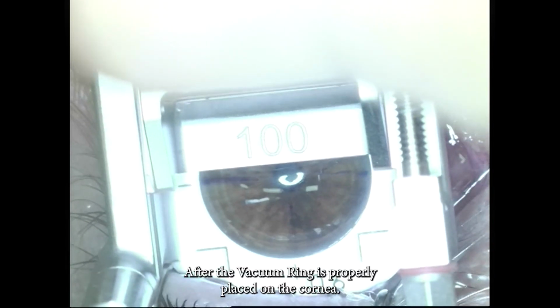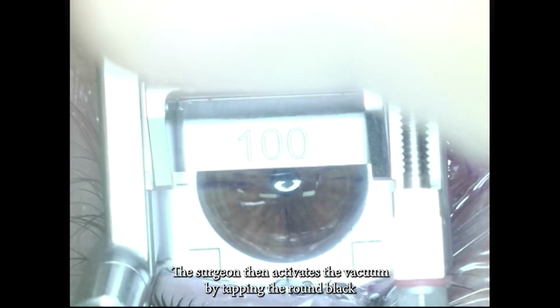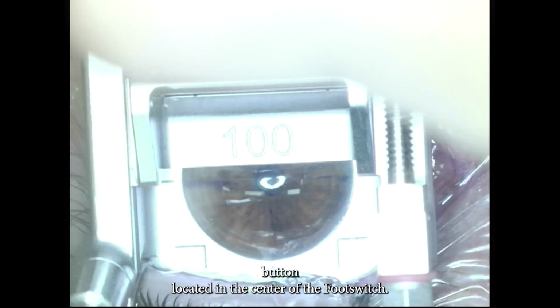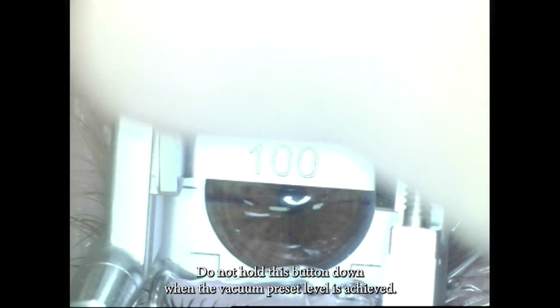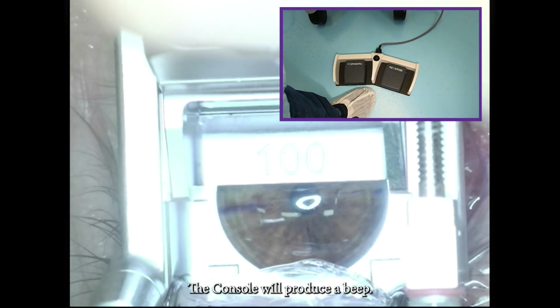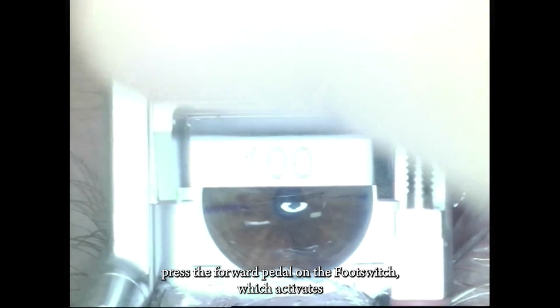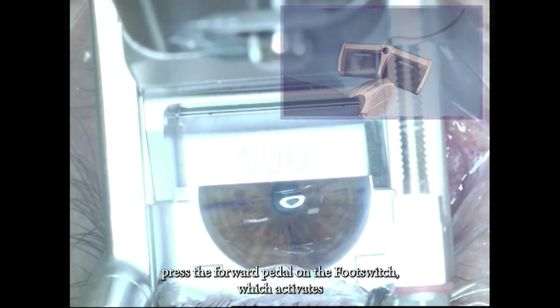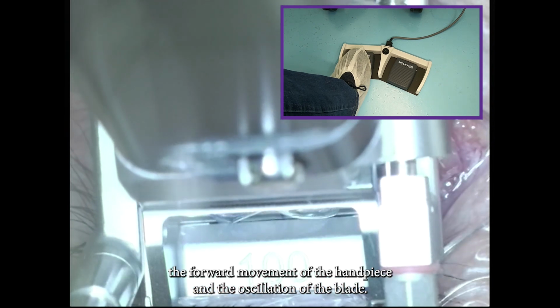After the vacuum ring is properly placed on the cornea, the surgeon then activates the vacuum by tapping the round black button located in the center of the foot switch. Do not hold this button down. When the vacuum preset level is achieved, the console will produce a beep. This sound is an indication that the surgeon can then press the forward pedal on the foot switch, which activates the forward movement of the handpiece and the oscillation of the blade.